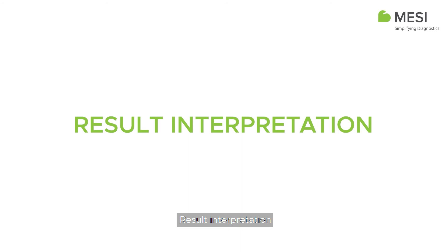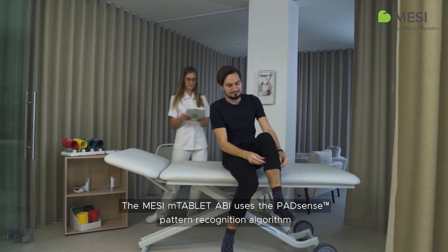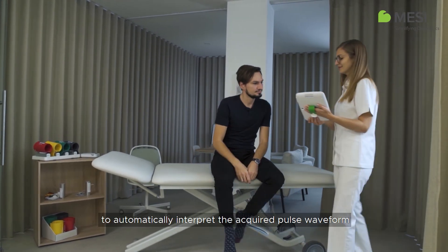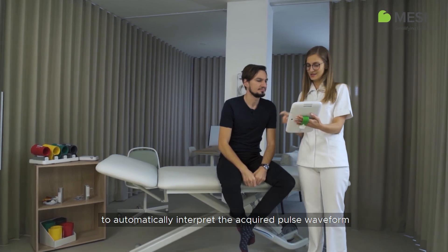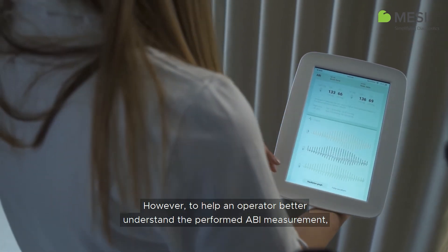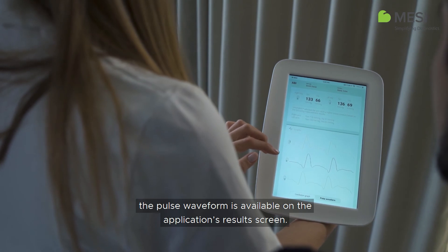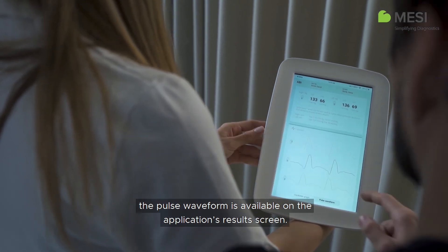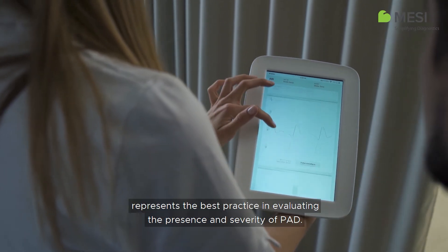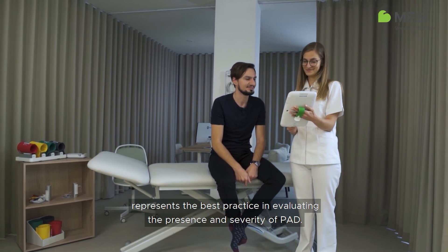Result Interpretation. The Macy M-Tablet ABI uses the PAD Sense Pattern Recognition Algorithm to automatically interpret the acquired pulse waveform and calculate the ABI result. However, to help an operator better understand the performed ABI measurement, the pulse waveform is available on the application's results screen. Combining both the ABI result and pulse waveform represents the best practice in evaluating the presence and severity of PAD.